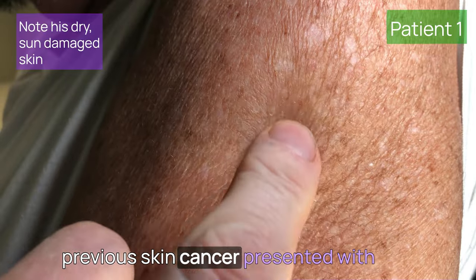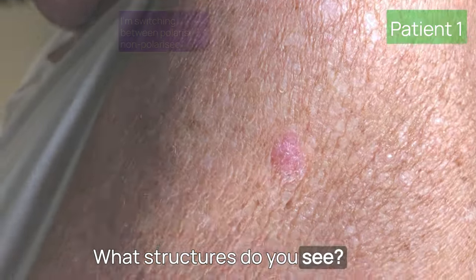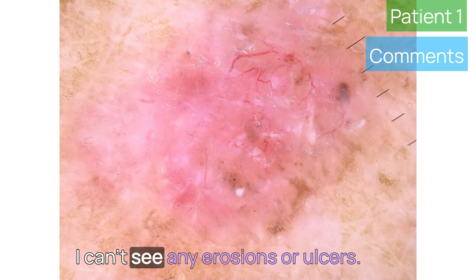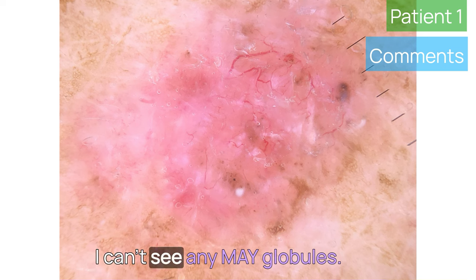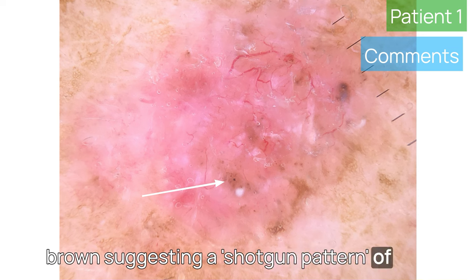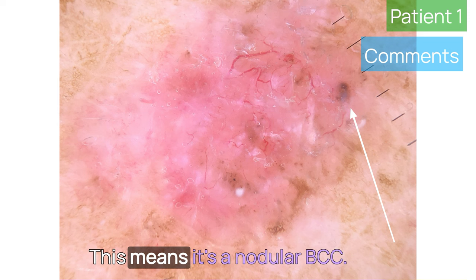This 78-year-old gentleman with no previous skin cancer presented with a six-month history of a red patch on his left upper arm. There are clear arborising vessels as well as fine vessels. No erosions or ulcers. You'll notice shiny white structures as I switch back and forth between polarised and non-polarised light. No MAY globules. There is pigment network in the surrounding skin — these are solar lentigos. There are some dark brown dots suggesting a shotgun pattern of pigment at the dermoepidermal junction, and there is a blue-grey structure — this means it's a nodular BCC.